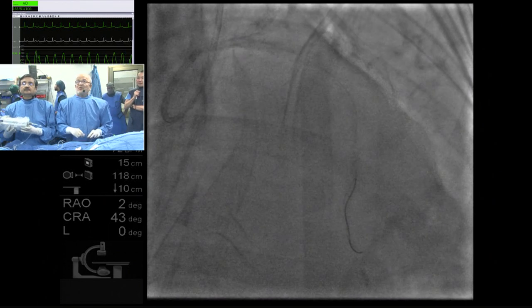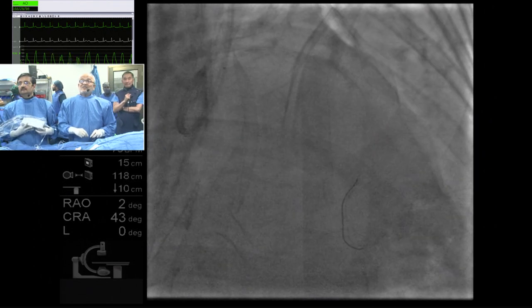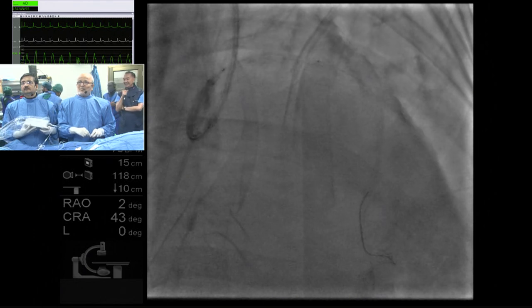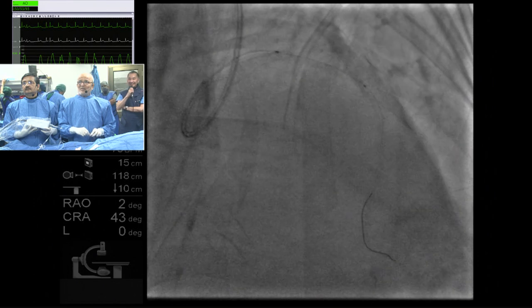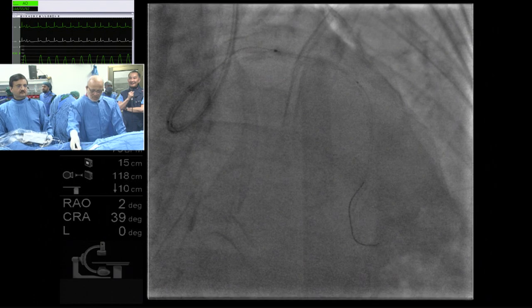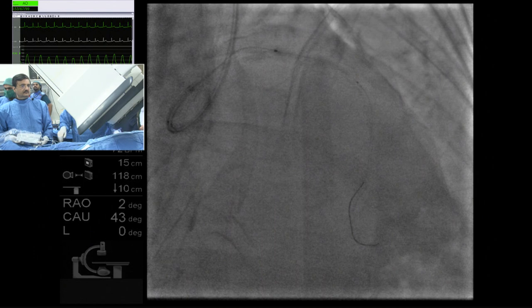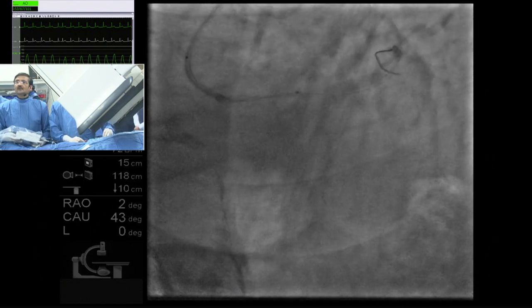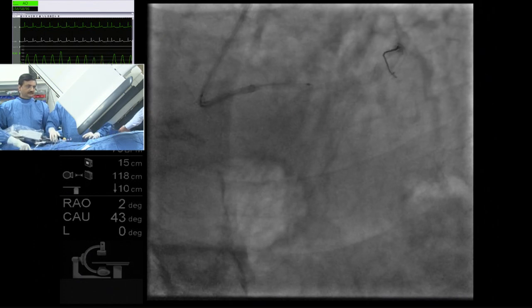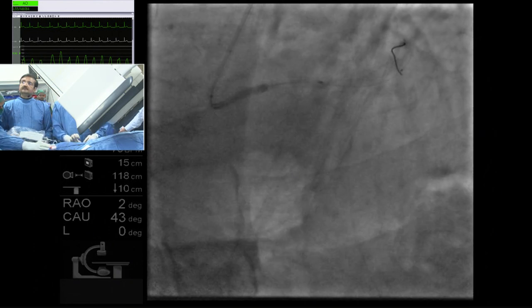So Dr. Tejas, as you said, most of the calcium looks to be adventitial. This is my prediction, my presumption. I may not be right, but let me see. So do you think this case would have been done only with IVL without rota? You realize that you can't do it, because pushing an IVL balloon in a diffusely calcified segment like this can be a challenge.